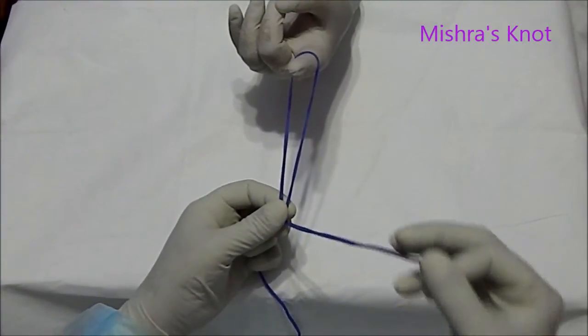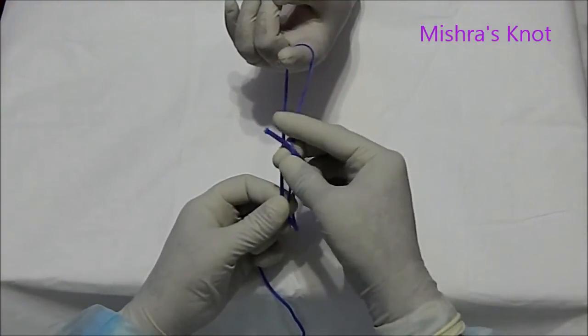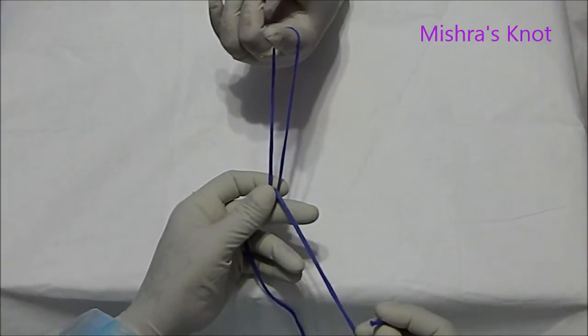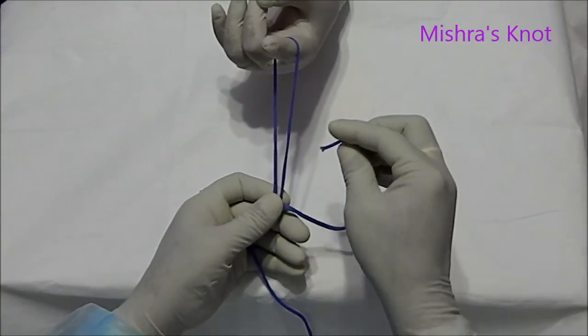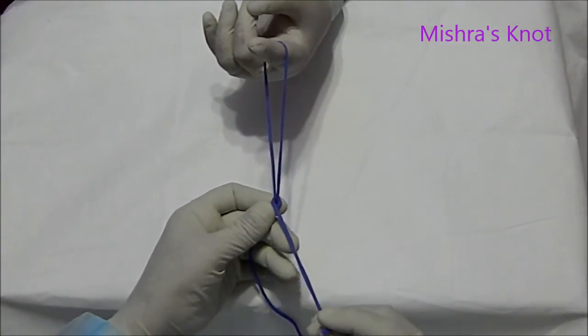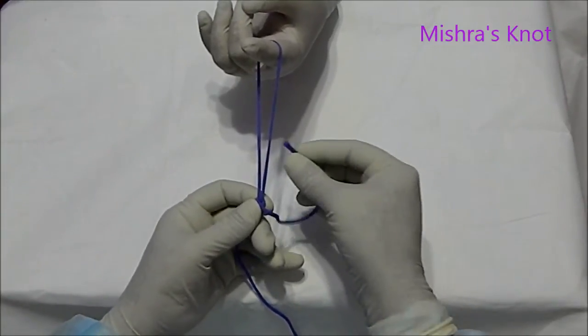A single hitch will be taken first. Then one wind will be taken. After one wind, you should take one half knot.